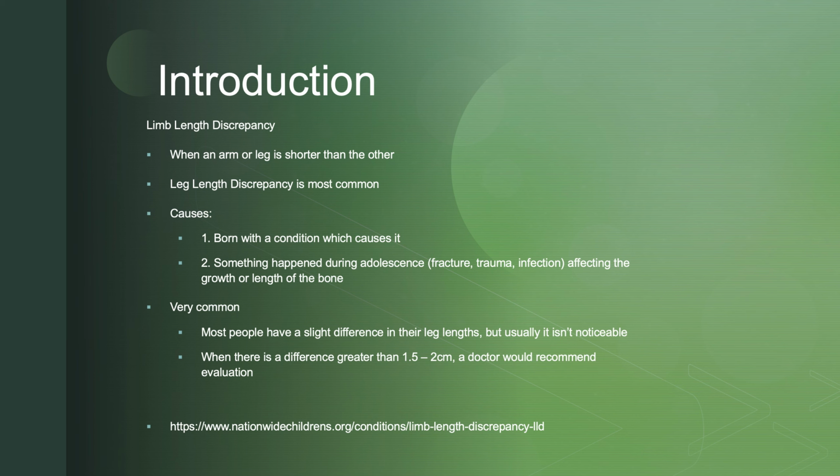Our project is a 3D printed shoe insert for someone who has limb length discrepancy, specifically leg length. Limb length discrepancy is when someone's arm or leg is shorter than the other and can cause issues in everyday life, especially if there's a significant difference.